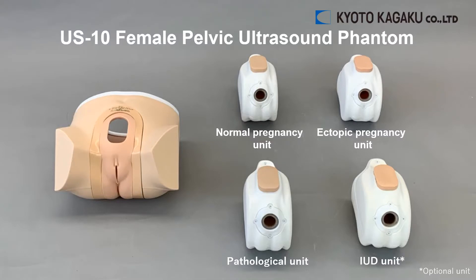Hello, today I will introduce the Kyoto Kagaku Female Pelvic Ultrasound Phantom. On the left side of the screen is the lower torso mannequin. On the right side are the four different units.